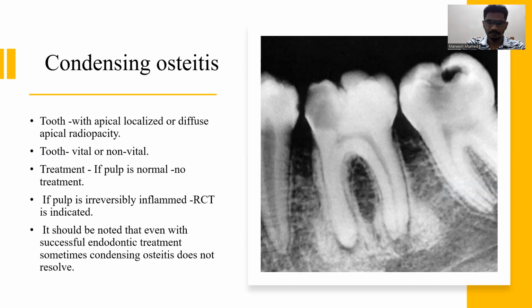It is usually seen in young patients, and the periapical response is usually by depositing bone instead of radiolucency. You can see a radiopacity associated with the infected tooth.